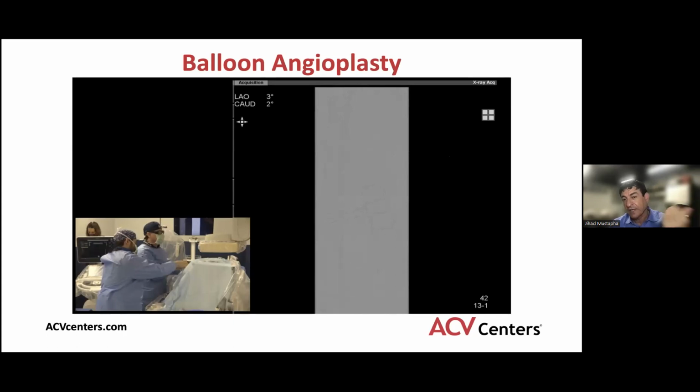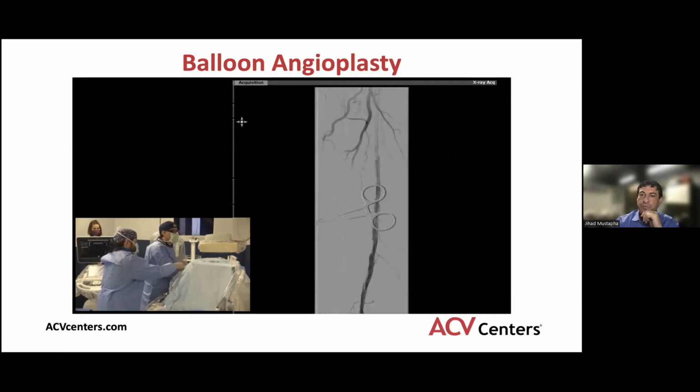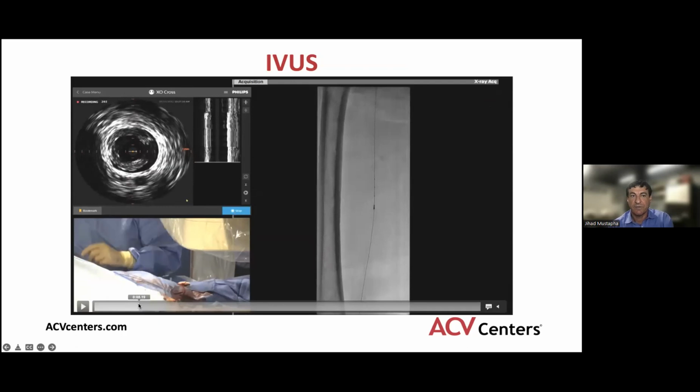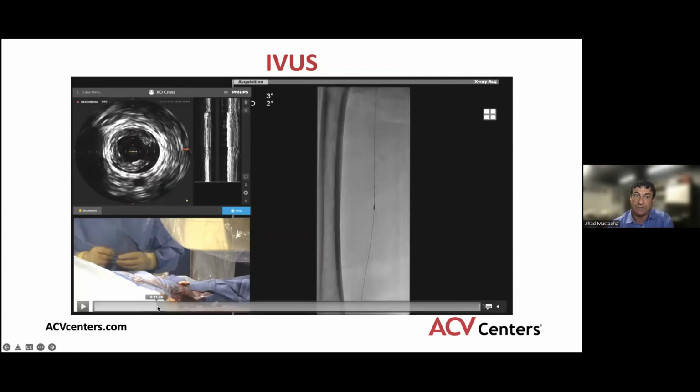As I go to the next slide, hopefully you're thinking about what you would do next for this patient. Here you go. Well, the best thing to do is repeat the IVUS, because if the IVUS shows that there is a significant reduction in the plaque and the flow is normal, then you just move on. But what happened here is there is a reduction in the plaque, a reduction in the thrombi. Remember, this was nearly occluded here with organized thrombus, but it's reduced significantly.